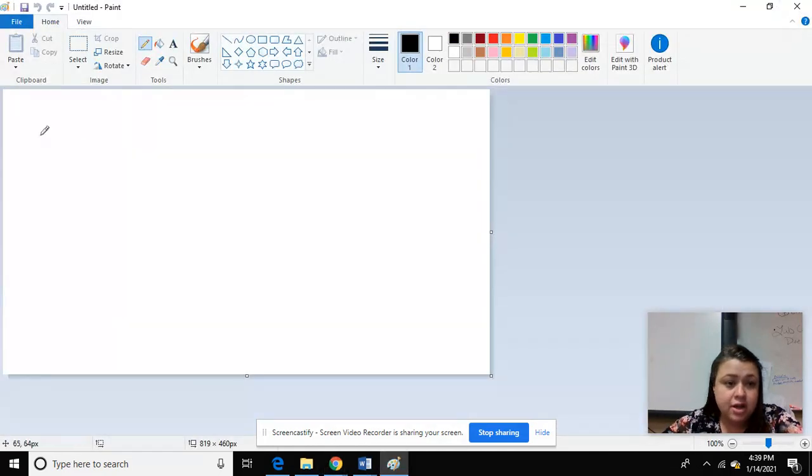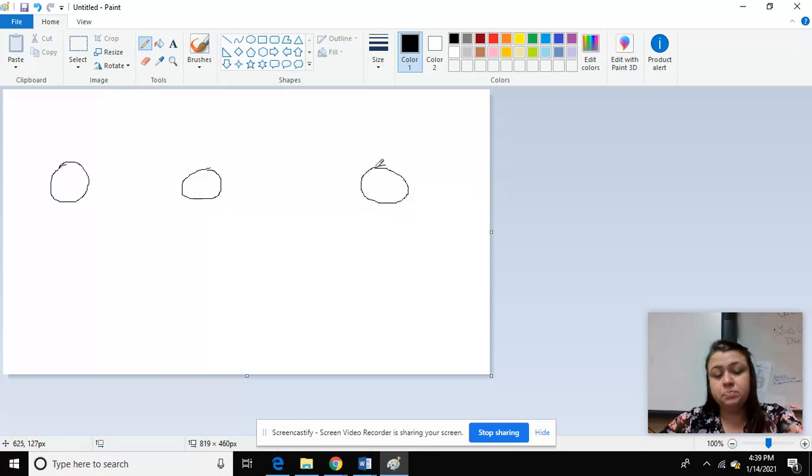So on visual, I like to use pictures. Here are our 3 separate wells. In each of these wells, this is actually going to be the cell. This is Diana's blood cell. Well 1, well 2, well 3, Diana's blood cell in each one of them. So into the first well, we want to see if she has A antigens on her blood. That will let us know if she has A blood or possibly AB blood.